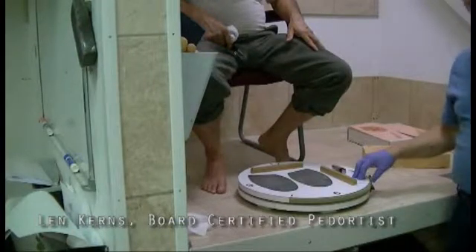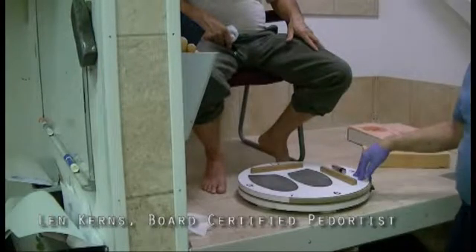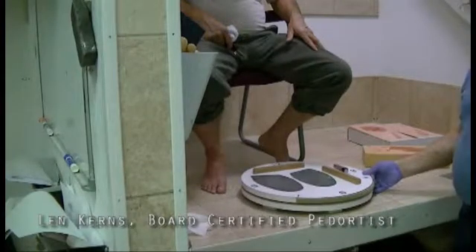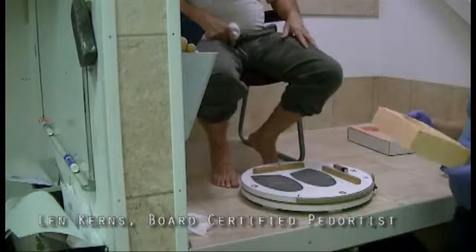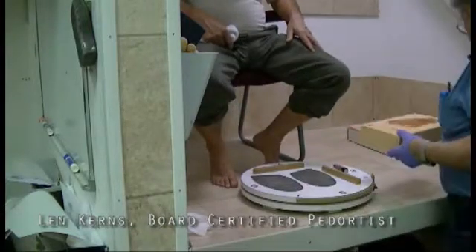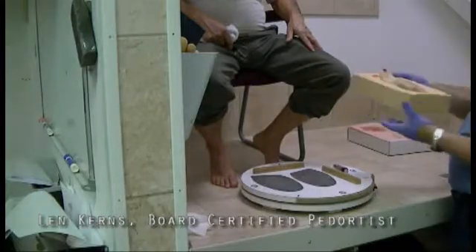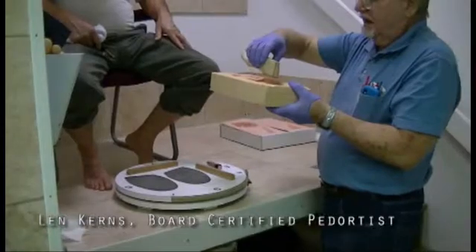Because for years I've been getting doctors sending me in bad casts, so me and the doctor I was working with decided there's got to be a way of using the foam box. Because biofoam would tell you to push the foot into the box halfway, and that would leave you to have the heel pronate, supinate. It just tells you to try to get it level.